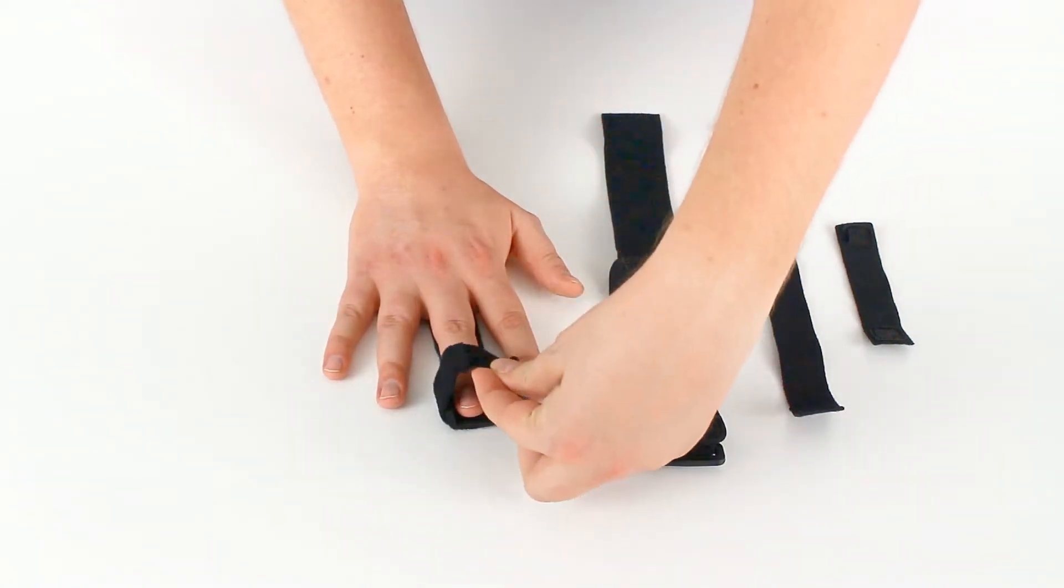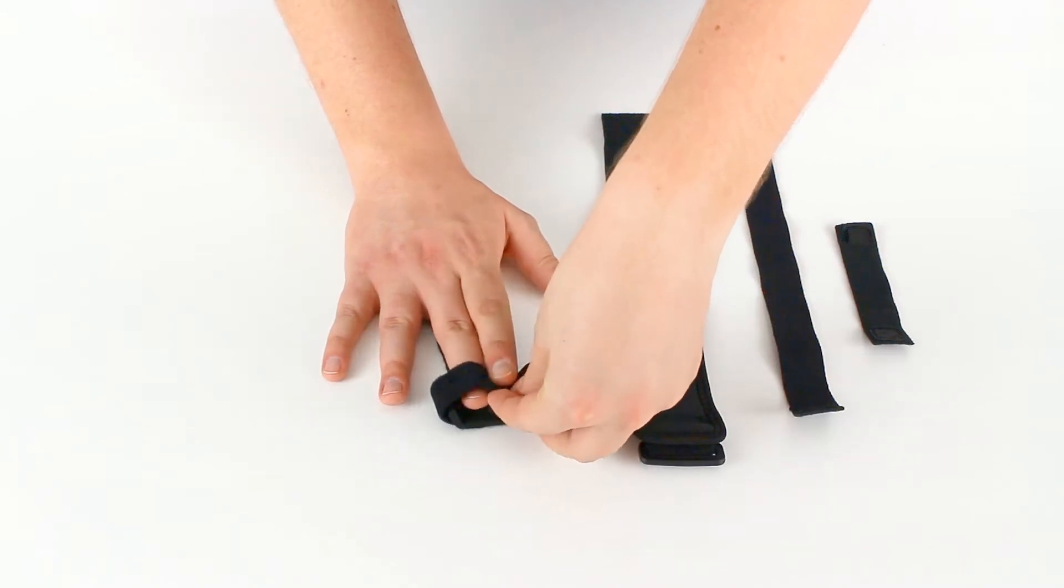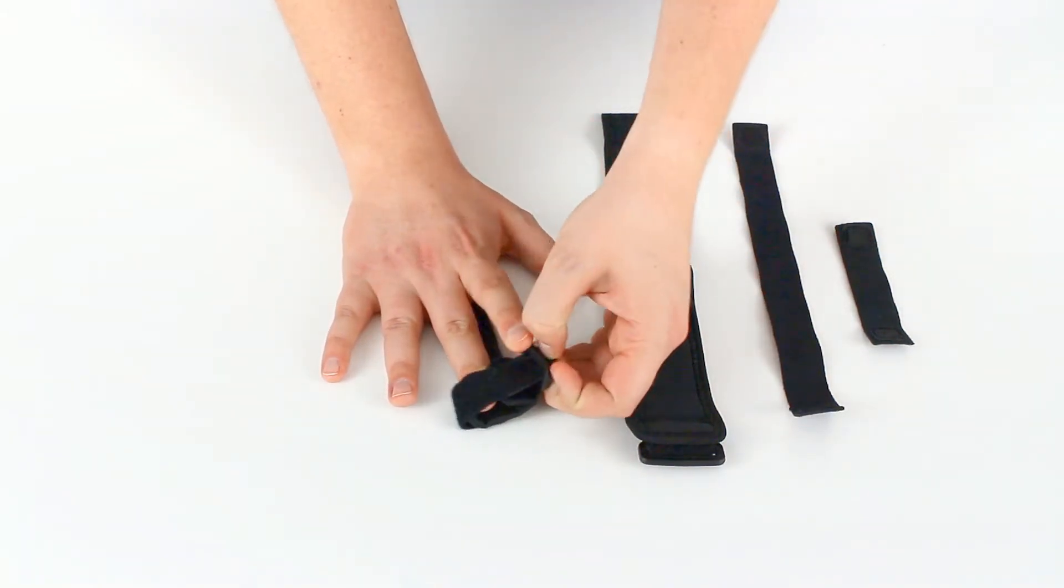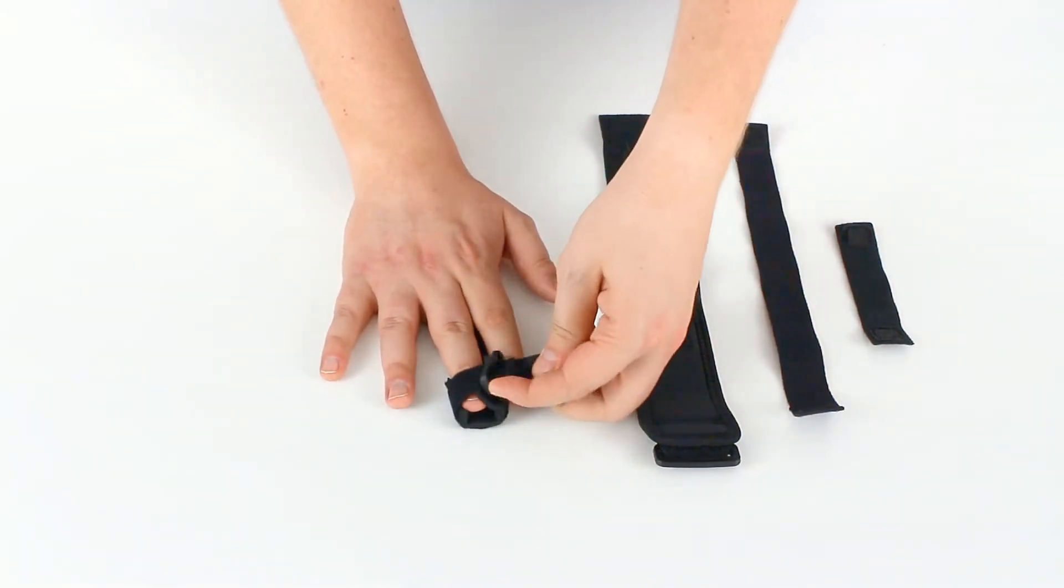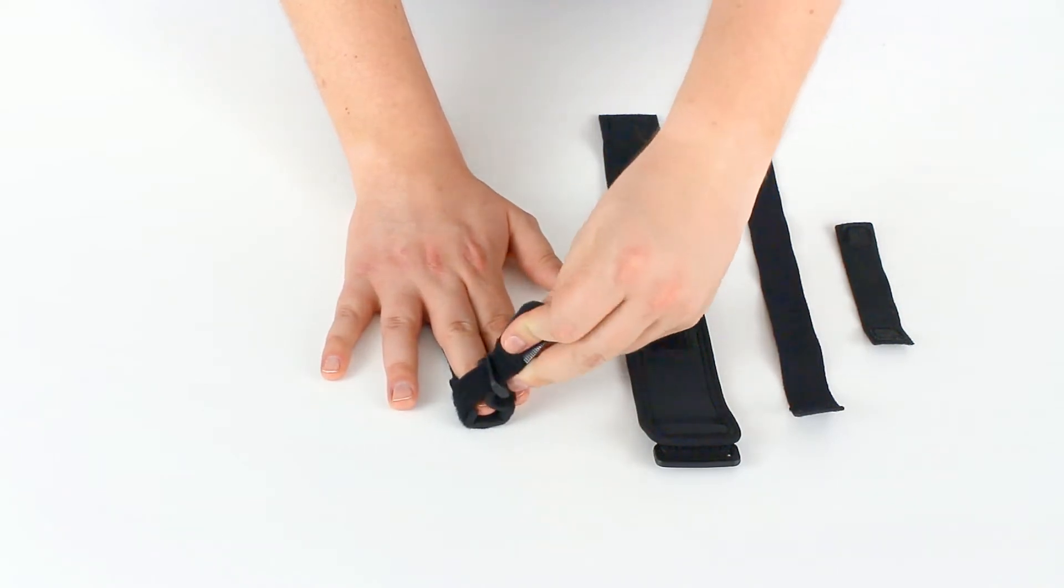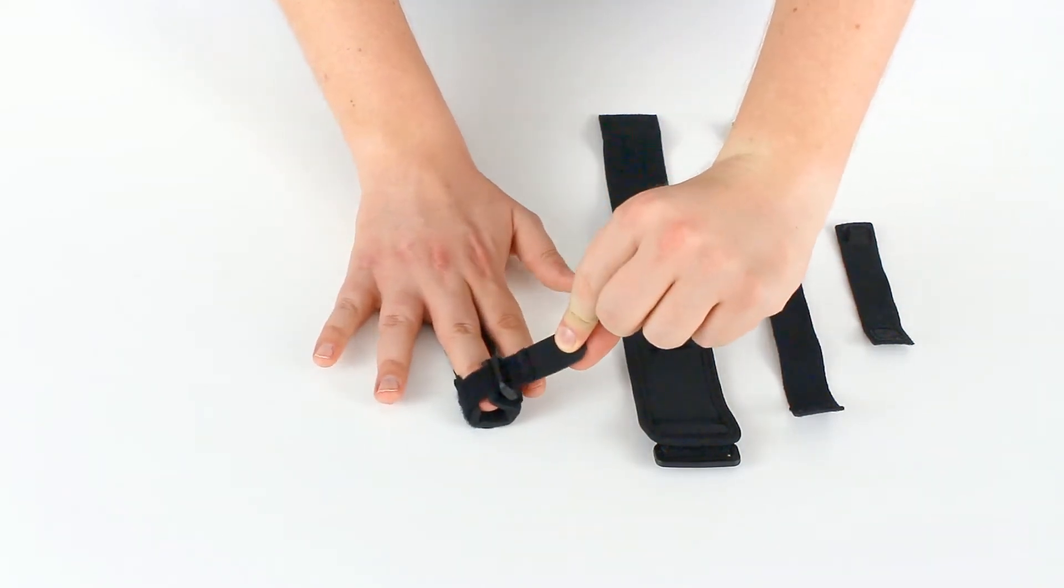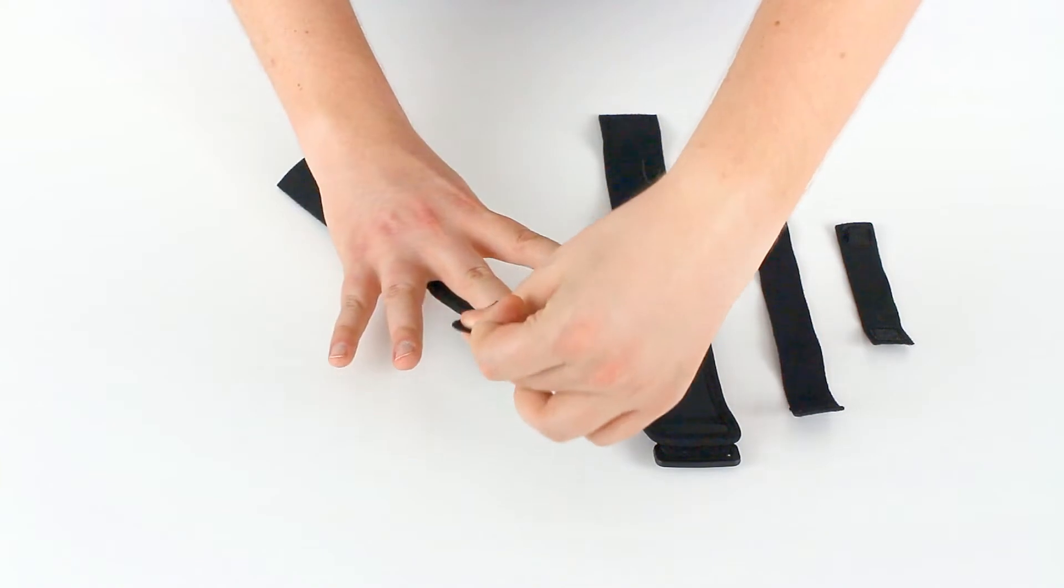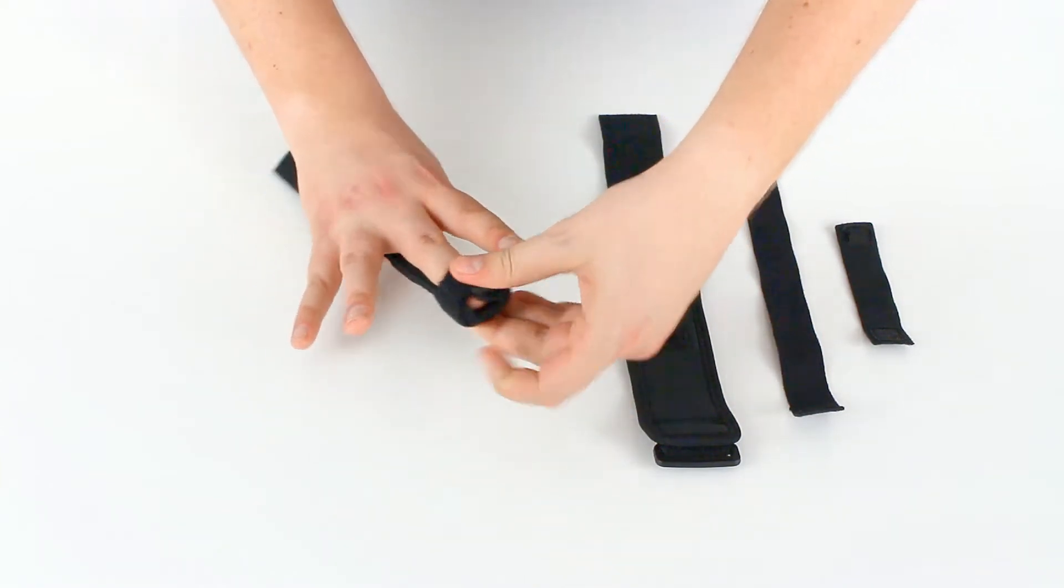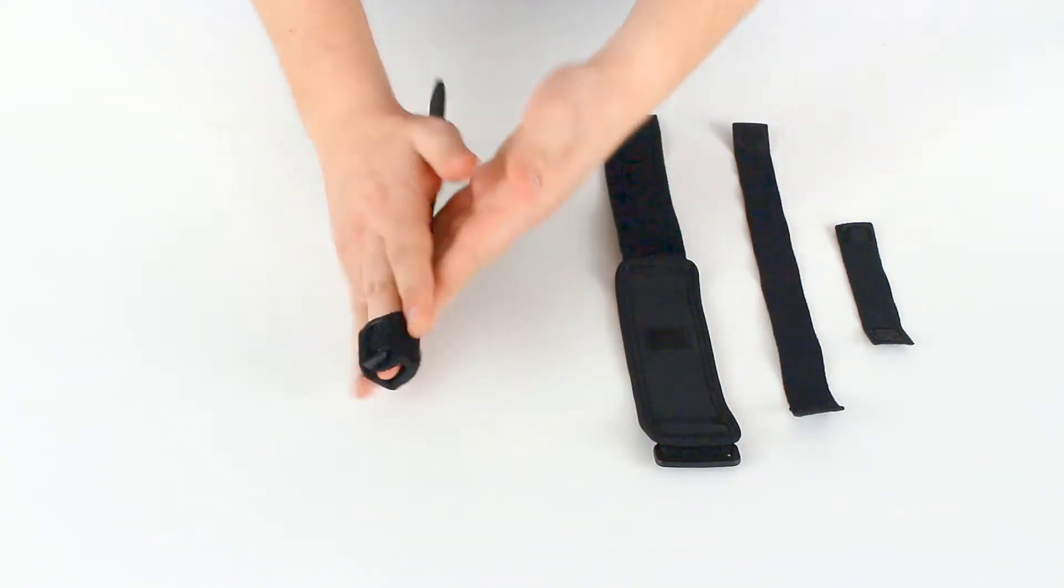Take the strap, feed it through the loop. Tighten that down. You don't want it to be too tight. You don't want to cut off circulation to your finger. Tighten that down. Strap that shut.